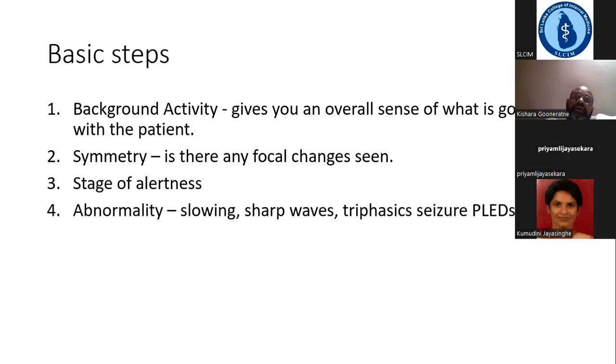One is we try to see if the patient would fall asleep, or at least make sure that the environment is conducive for them to fall asleep, and there is a reason for that. When they fall asleep and go into, say, N2 stage of non-REM sleep, there is activation of epileptiform discharges.